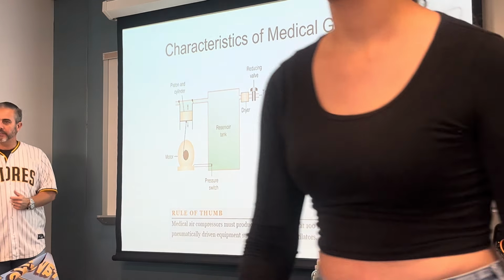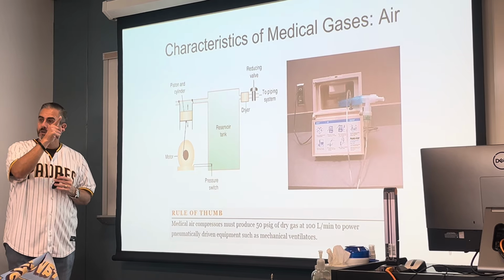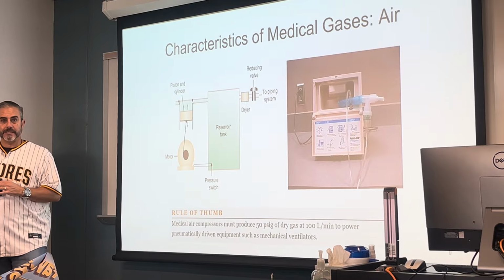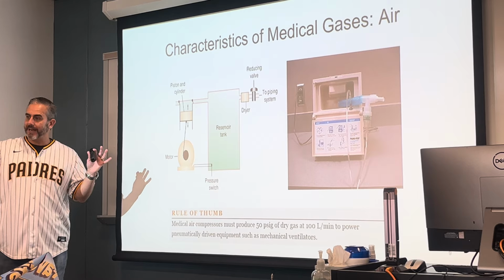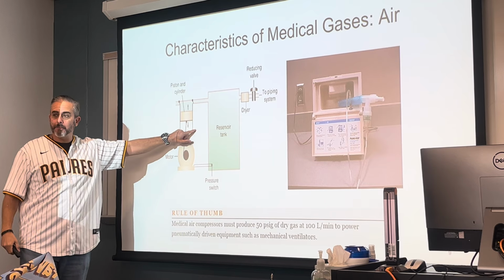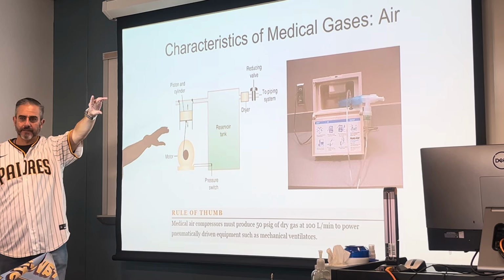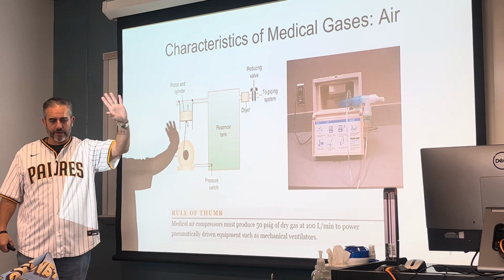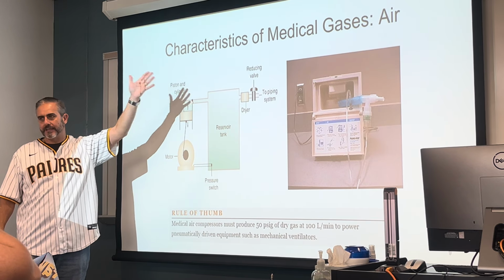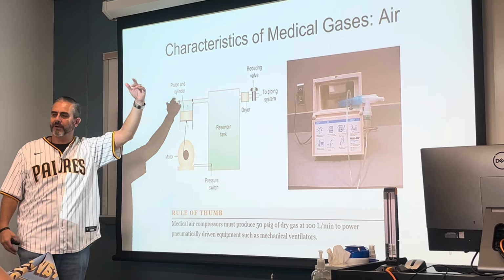Now I know you guys typically won't notice it. Maybe you'll notice it now that I mention it, but in our lab, we do have piped in oxygen. We have some big giant tanks behind the wall that you can't see, piping in that oxygen, but the room air flow meters, those yellow flow meters, are connected to a big giant air compressor that's on the roof. When you're outside the hall, going outside the building where the restrooms are, that stairwell, if you were to take that stairwell up, there's a fence, there's a gate, you can't go any higher, but if you were to go up there, you would actually see it. It's just not far above our lab.